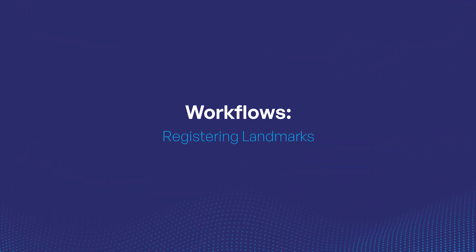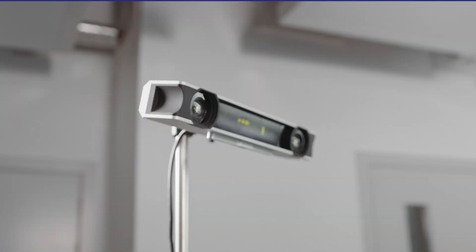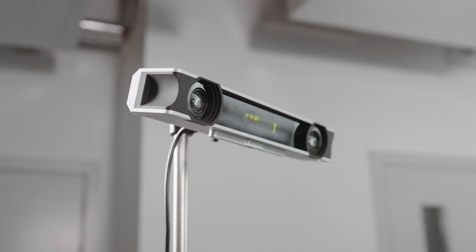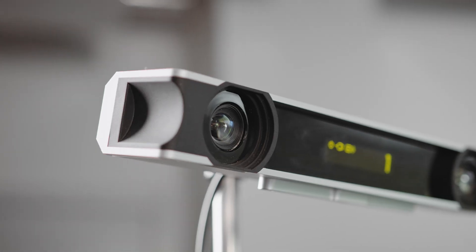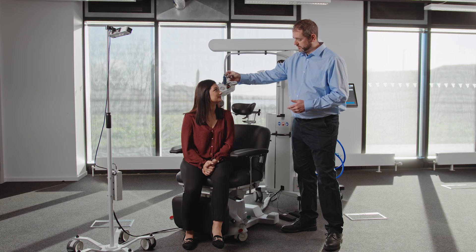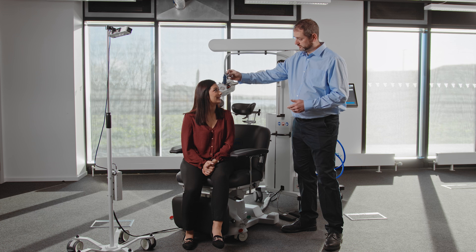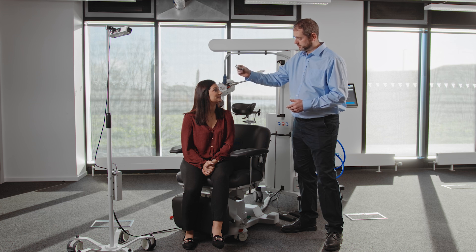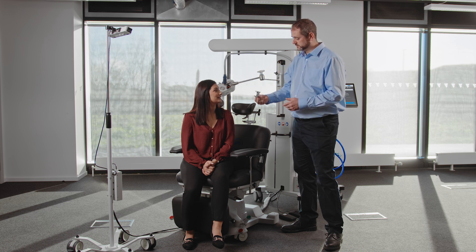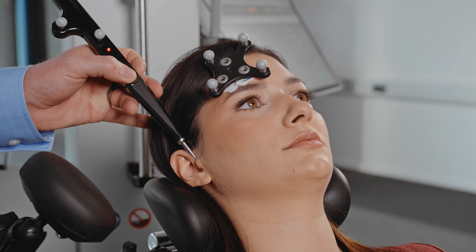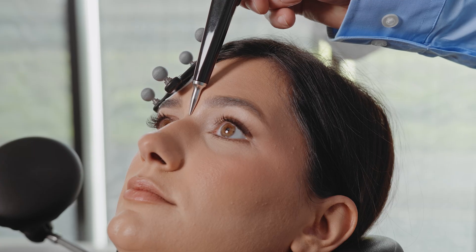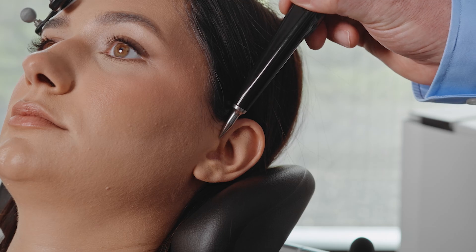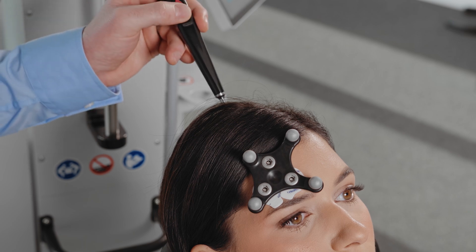Landmark Registration: Confirm that the camera is switched on, indicated by the digital display in the center of the camera. Inform the patient not to move the affixed head reference tool and to inform the TMS technician if this occurs. Ensure all TMS technicians are using the correct landmark locations for treatment consistency and accuracy.